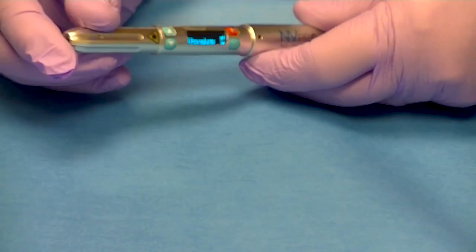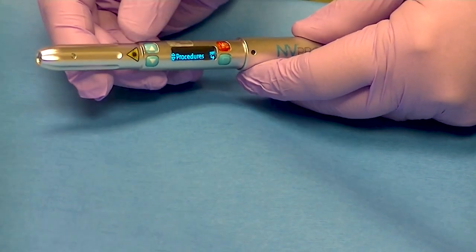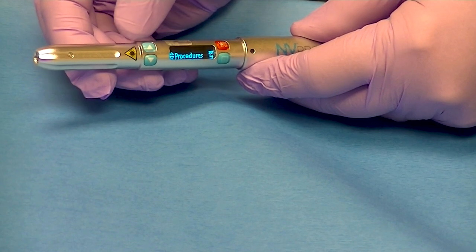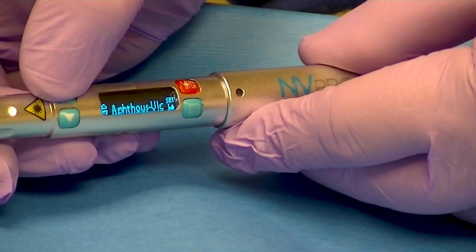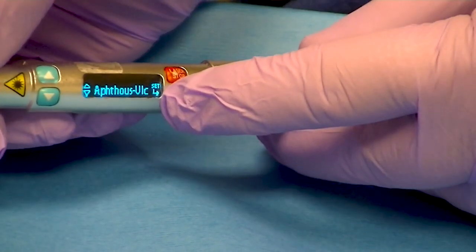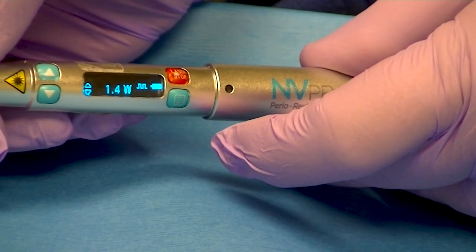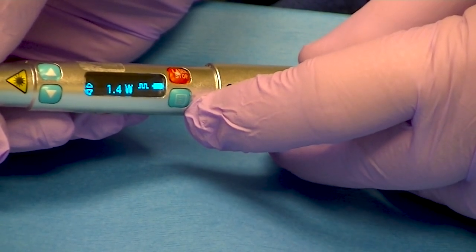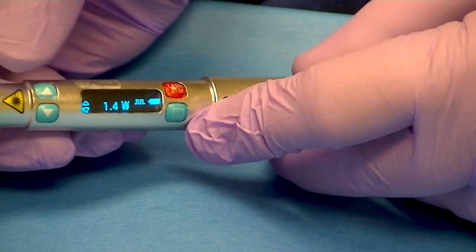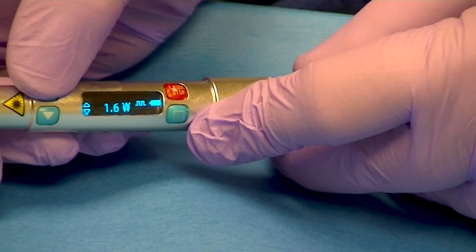It says on there: 'procedure.' You're going to scroll either up or down — you can see the arrows going up or down — and it will say 'aphthous ulcer.' If you hit the menu again, it'll give you the lowest setting for that aphthous ulcer. Sometimes we want to increase the wattage, and we can simply do that by pressing it either up or down to the setting that you want.